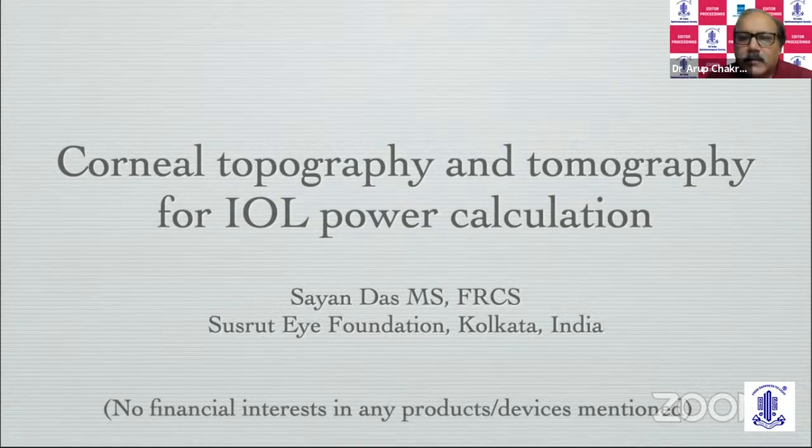So, Sri Ganesh here. We'll take the last comment before Sayan starts his talk. You get this problem with scarred corneas when you want to do a combined keratoplasty and cataract surgery, and you're not able to get the K readings. In that situation, what we do is we take the K readings of the other eye and then calculate the IOL power, because anyway you will be doing a keratoplasty, so that is kind of approximate if you are not able to get accurate K values. And the other point I wanted to make is, don't interchange and use K values, because different devices have different zones.